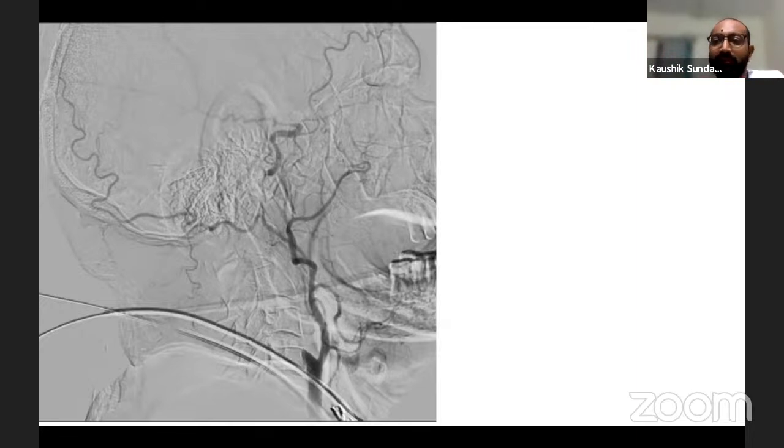Because you know that this is a diseased artery and you know there is an alternate conduit that is supplying. The reason the patient is symptomatic is the distal M1 occlusion, correct? So as long as you have that in mind, then you can pass your carotids, because unless you have strong support, your other catheter system is not going to track.